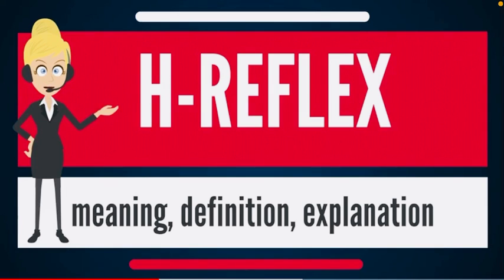An M wave, an early response, occurs 3-6 ms after the onset of stimulation. The H and F waves are later responses. As the stimulus increases, the amplitude of the F wave increases only slightly, and the H wave decreases, and at supermaximal stimulus, the H wave will disappear.